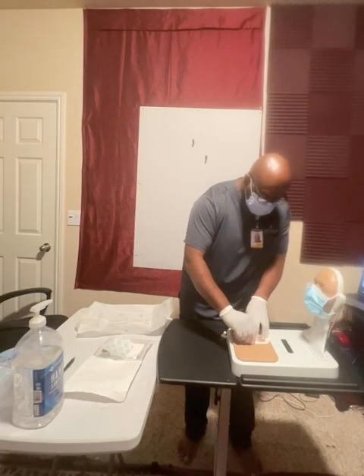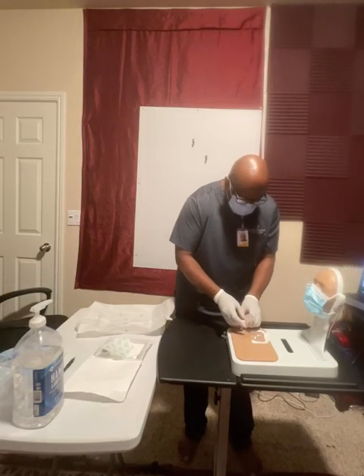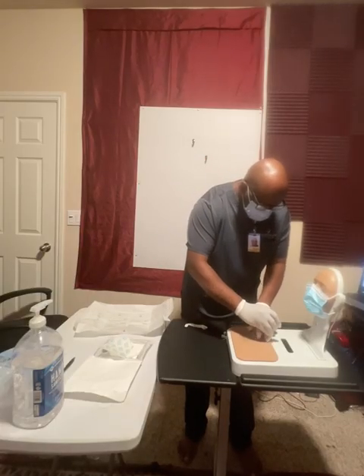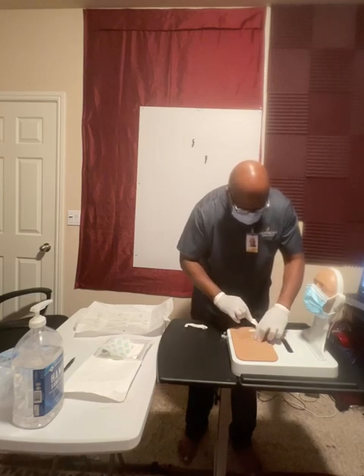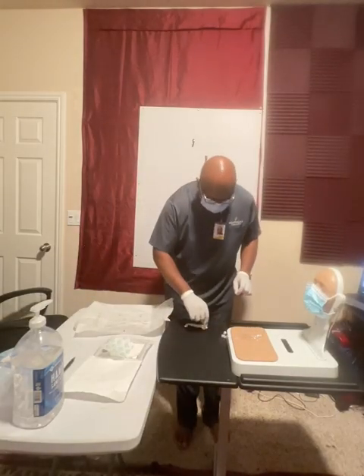So we're just going to unpeel the edges on this transparent dressing, this Tegaderm dressing. All right, we're going to go ahead and pull that off. This is the side that has the tape on it. We want to make sure we save that, and pull off the other edge. We still want to make sure that we are taking good notice and care of stabilizing the catheter. Just throw that one away.